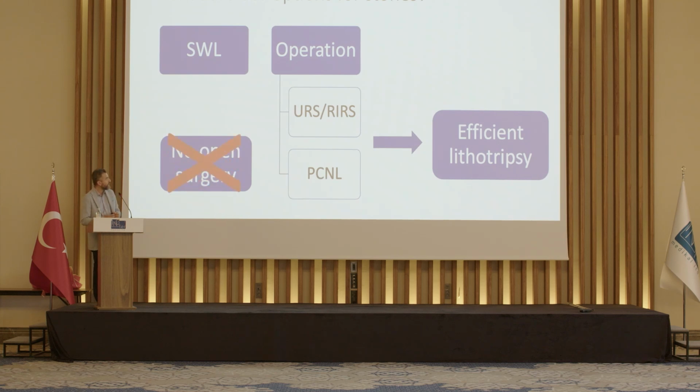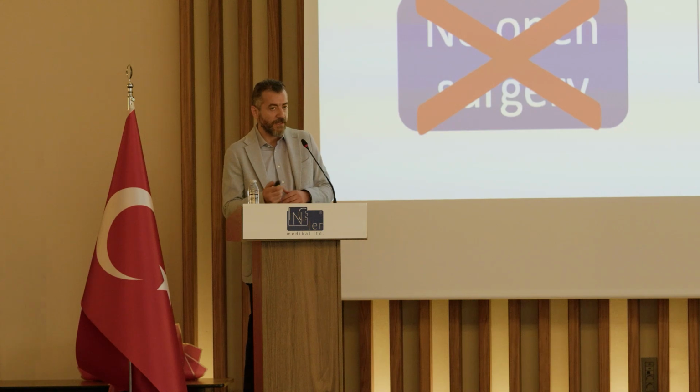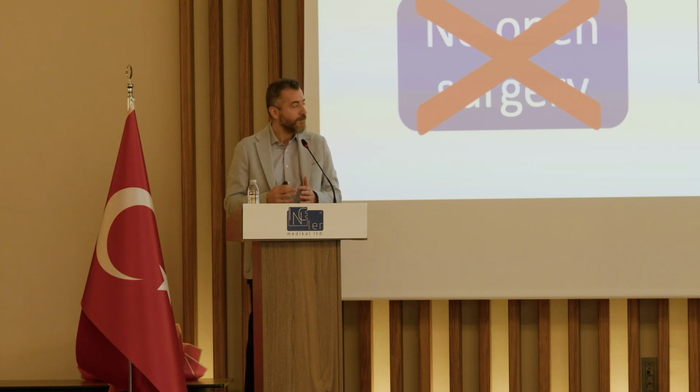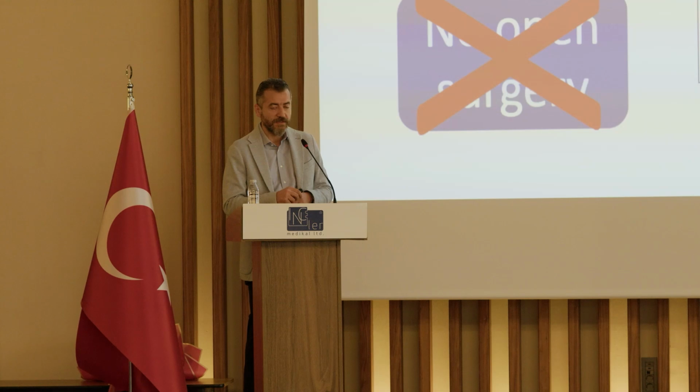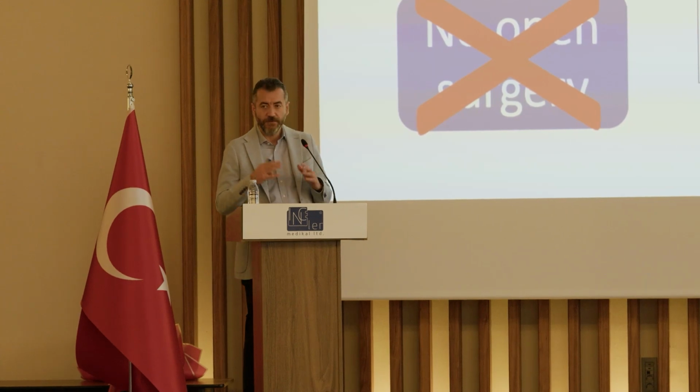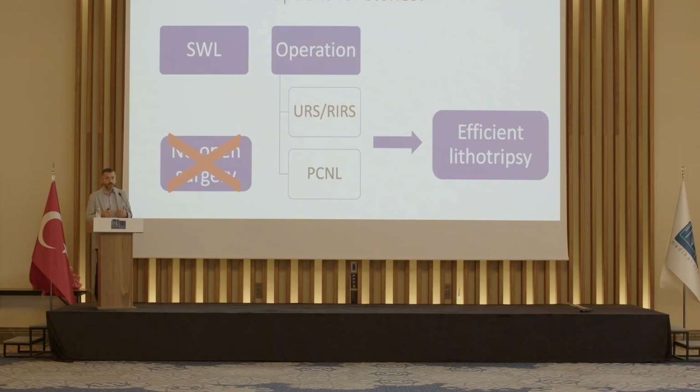So for stones, what we have as options is, first of all, the shockwave lithotripsy that's still on the market. It's a very effective technology to disintegrate the stones without any operation. And other than that, we also have the operations, and depending on the size of the stone and what we have inside, we mainly have two options. One is the ureteroscopy, the keyhole surgery that we go through the urethra, and do every ureter and the kidney and do everything from the natural orifice. And the other one is the PCNL, that we drill a hole from the skin, get into the collecting system of the kidney, and fragment the stone and take them out of the body. So in order to establish a good surgery, you need to have an efficient lithotripter to fragment the stone.